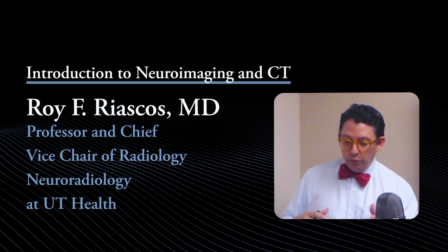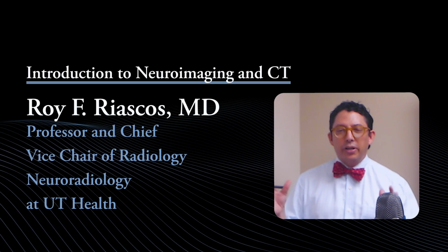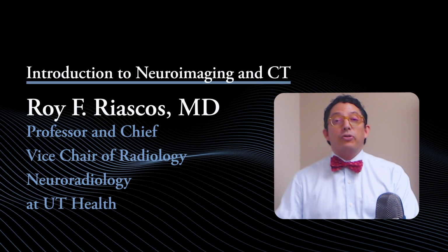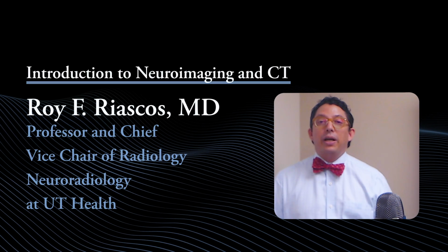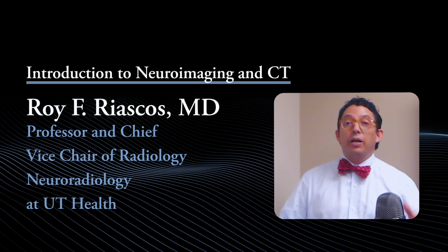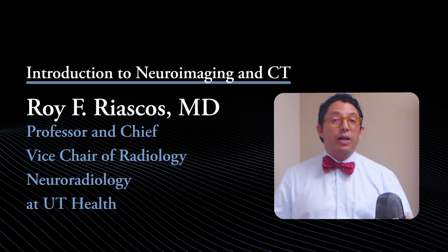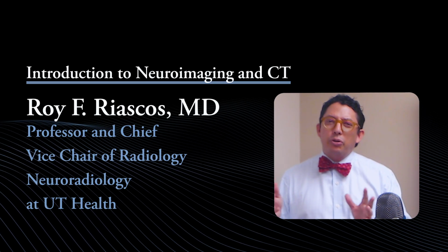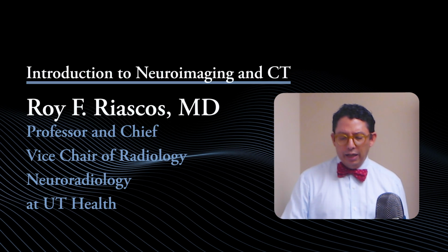So we have to display the Hounsfield units, which are the grayscales of CT, by using some tricks, which we call windowing and leveling. So it is impossible to just read a CT of the head using the one displayed image you have, because you would be missing a lot of the lesions that you have underneath it. Today we're going to touch base a little bit on windowing and leveling.